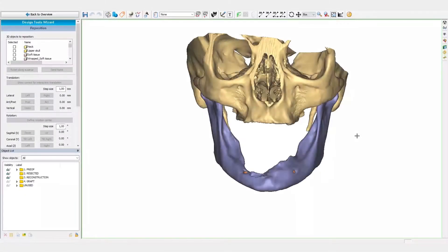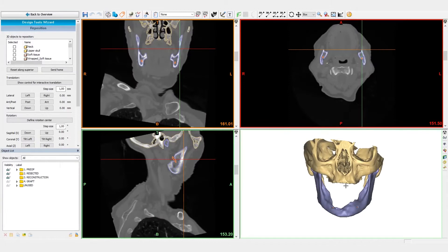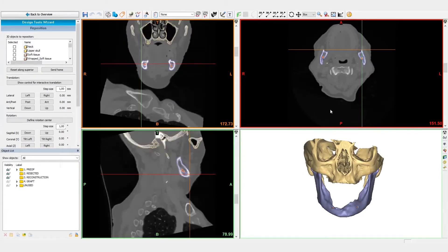Welcome to this ProPlan-CMF video. In this video, we will simulate a mandibular tumor resection and a reconstruction with a Fibula-free flap by using ProPlan-CMF.